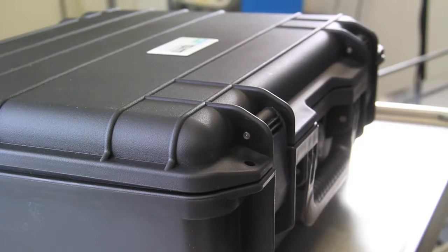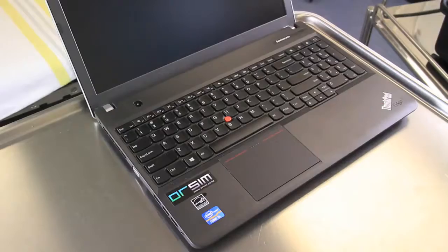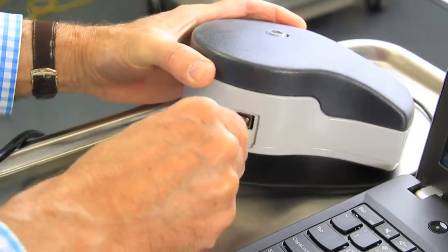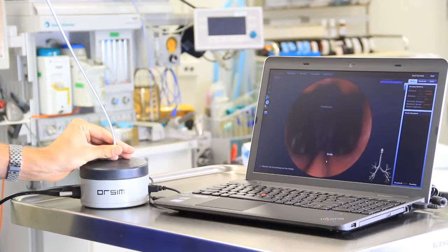The Awesome is quick and easy to put together and can be done in under five minutes. You get the simulator out of the hard case and there are three main parts: you plug in the laptop, connect the desktop sensor to the laptop with a USB cable, screw the proxy bronchoscope into the side of the desktop sensor, turn on the computer, wait for the software to load, and away you go.